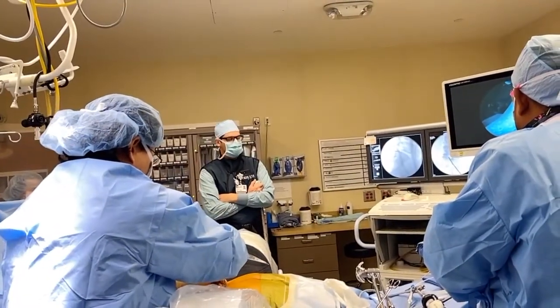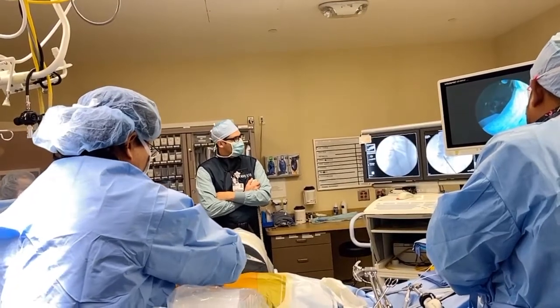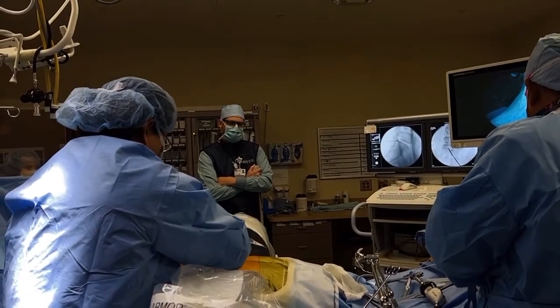Oh yes, anything? That makes sense. That I like. I like knowing that you've got something going on. So I bet you that's the disc herniation. It's not letting me push in anymore.